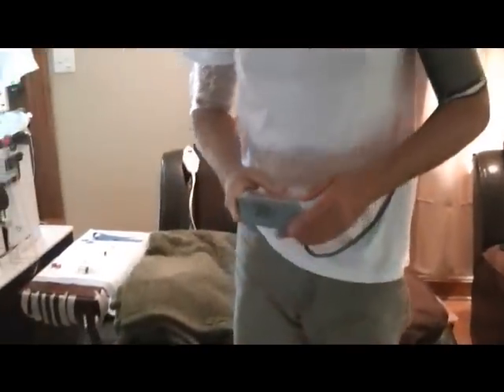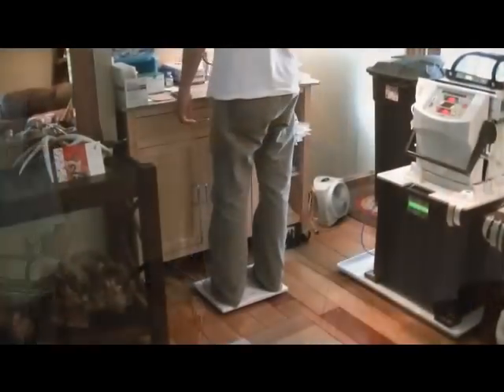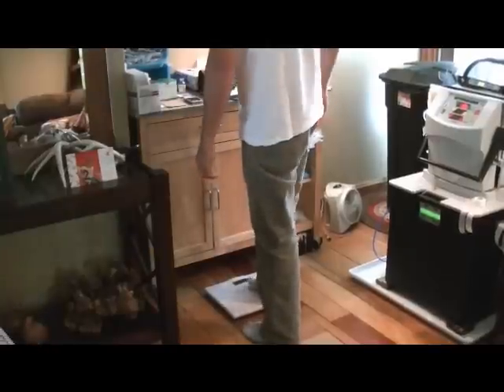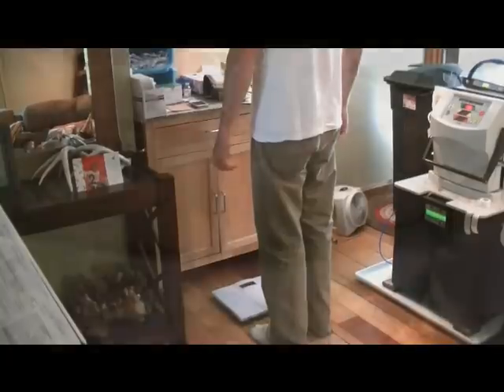Now he's checking his temperature. The main reason we do his temperature before is to check for any kind of infection in his arm — that's pretty important. 98.6. Plus if there are any complications during or afterwards, the temperature can be one of the things that changes right away. Now he'll do his standing blood pressure and then his weight. His dry weight is 80.5, but if he's been doing a lot or we do it at a different time of day, sometimes the weight's a little different so we adjust it. Then we remove the saran wrap.